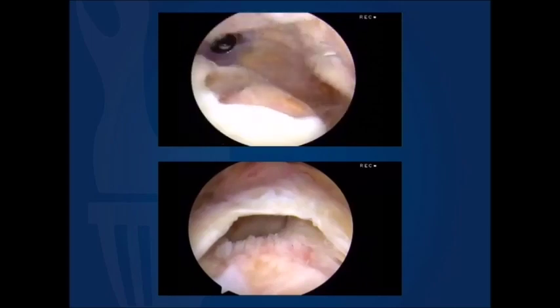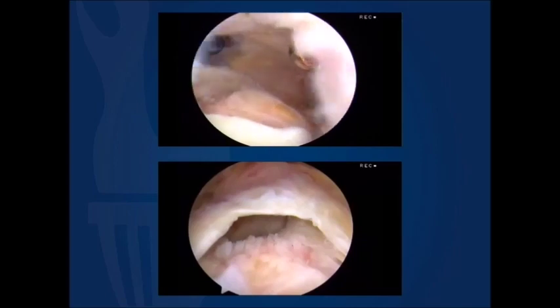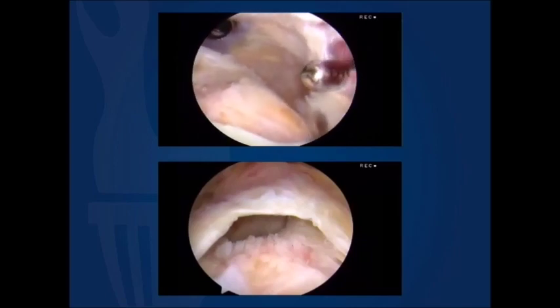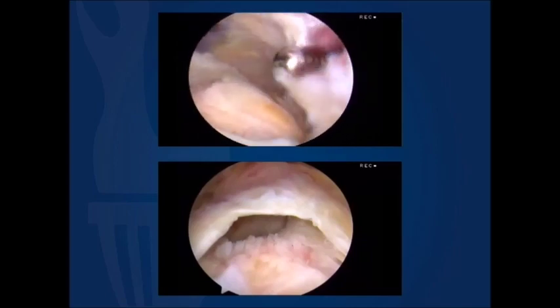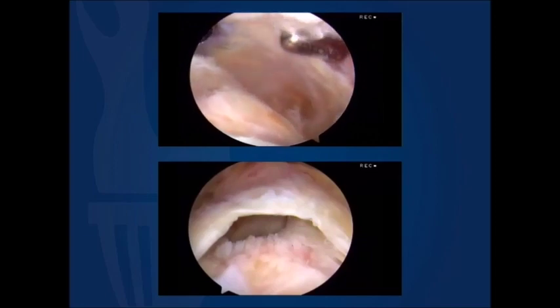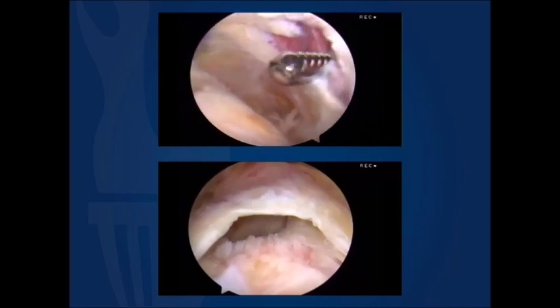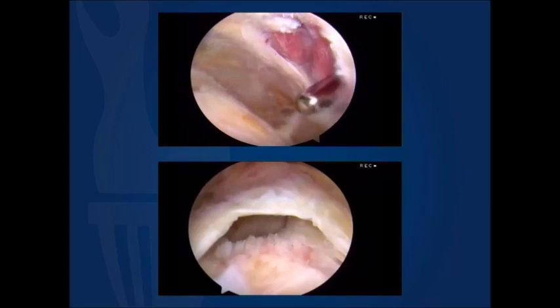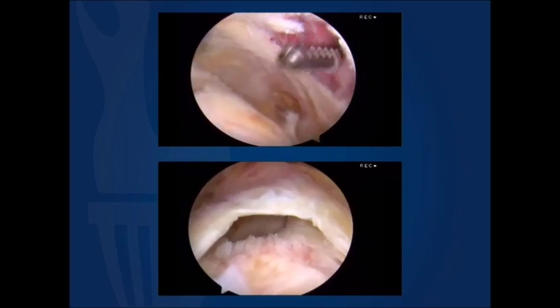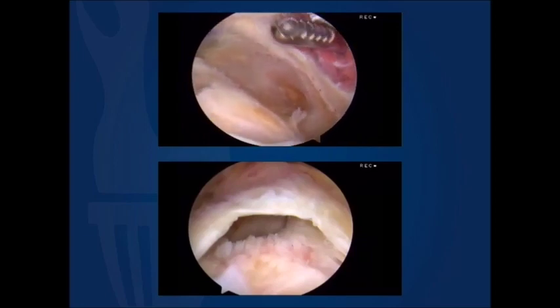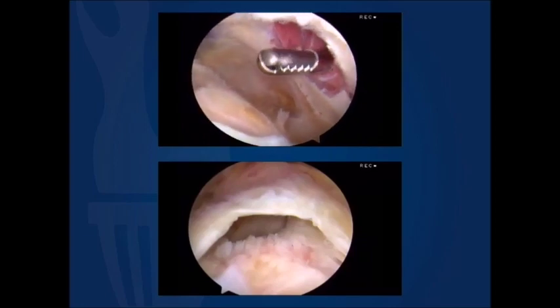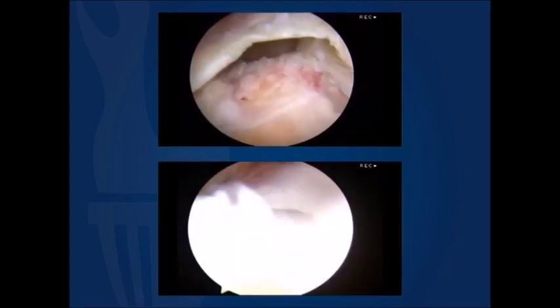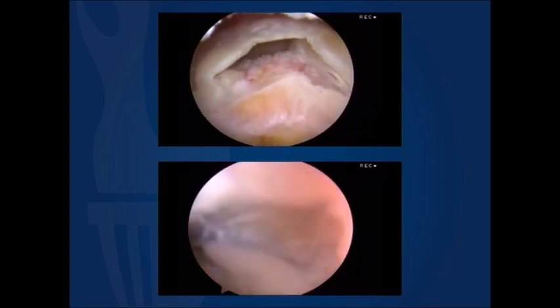The technique we want to demonstrate is simply a limited fasciectomy, shown here while viewing from the posterior perspective. This allows us to back the camera up slightly further — a centimeter or so typically. As I simulate our ability to back the camera up with the shaver blade, that small amount of additional backing up improves the visualization greatly.